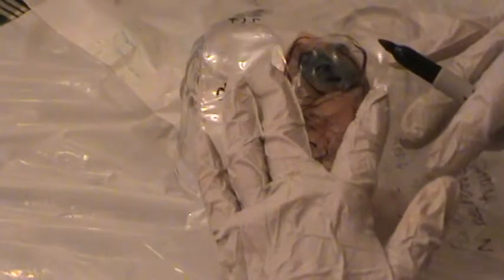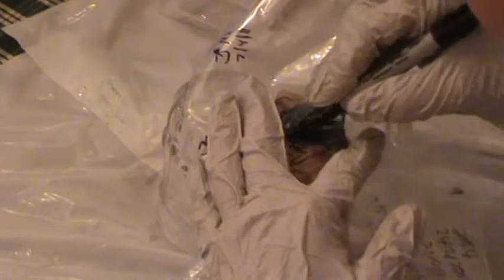A little tricky. I actually see that my tracing needs a little fine tuning on my necrotic area, so I'm going to double check my measurements here before I actually measure. I see that I could just make this a little bit more exact, my necrotic area.